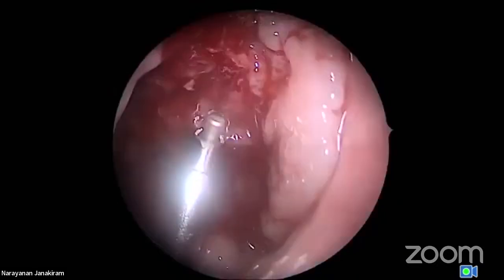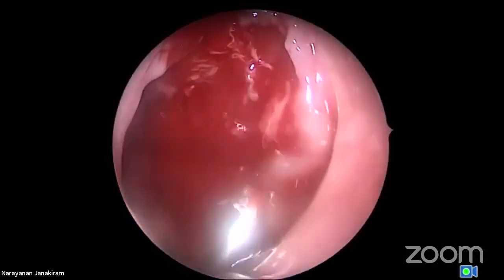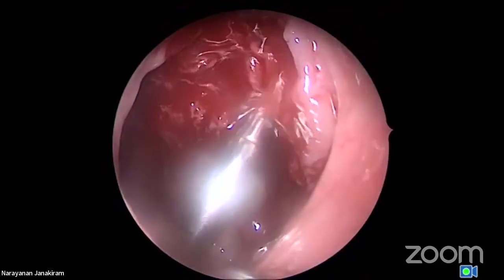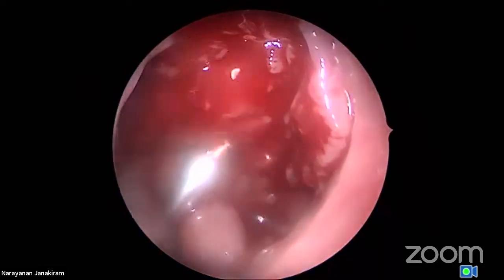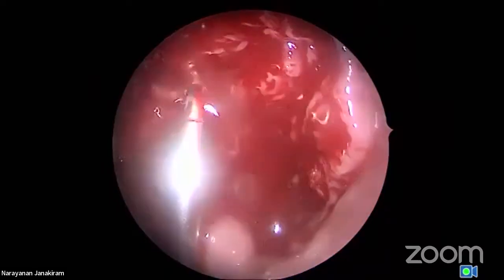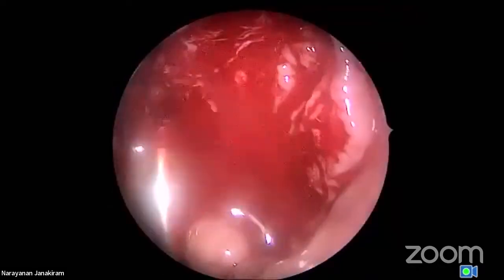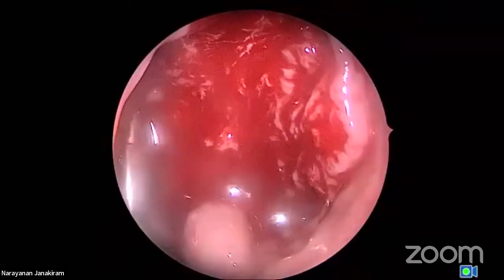This is the tubal tonsil. This is over the eustachian tube. Don't damage the eustachian tube, but you have to take the tubal tonsil out. Okay, that's the salpingopharyngeus fold. Oh, good, Radha. Now the movement is always like this, side to side. See here. This is the movement, because you don't want to hit the perimysium of the muscle. You understand? So that's the first part of the surgery.